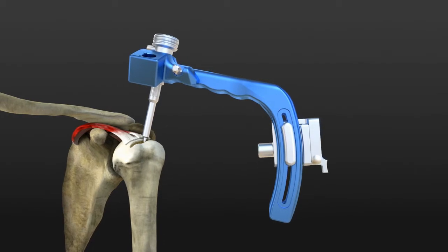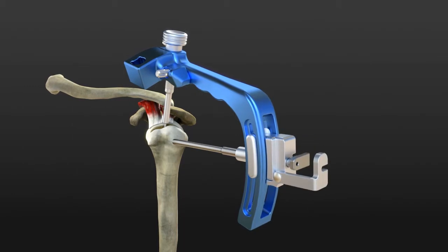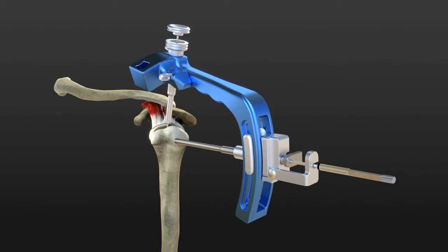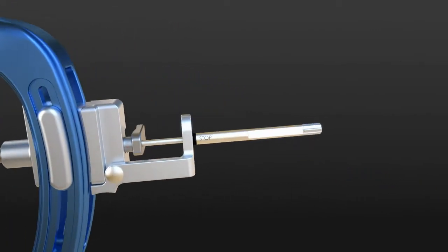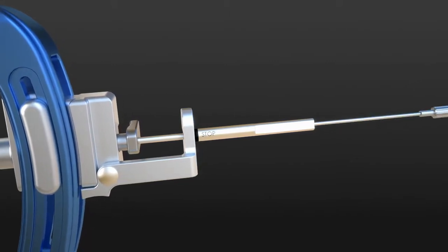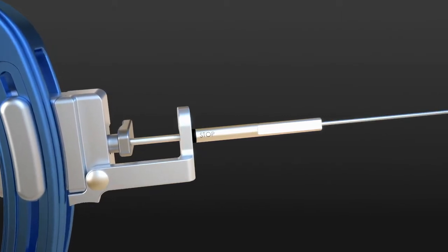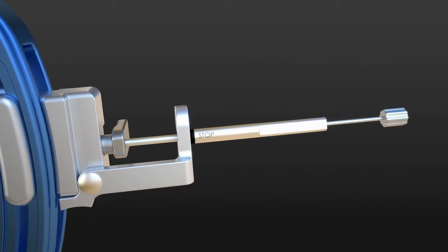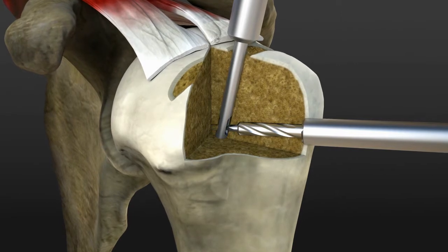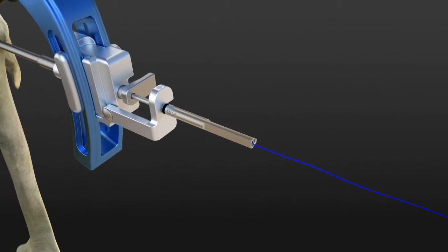Insert the lateral cannula on the movable guide on the side to reach the lateral cortex. Lower the side stop of the movable guide and insert the 3 mm cannulated drill bit. Run the drill to create the opening of the transosseous tunnel until the lateral stop. Remove the drill shutter, keeping it in position, and insert the K-wire with the knob. Lift the vertical suture blocker and push the K-wire until it stops. You can verify correct passing of the K-wire by acting on the suture blocker.